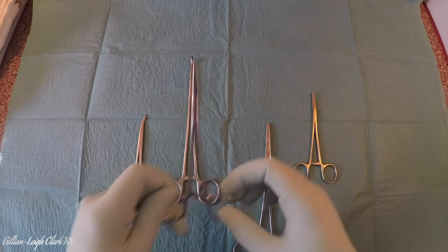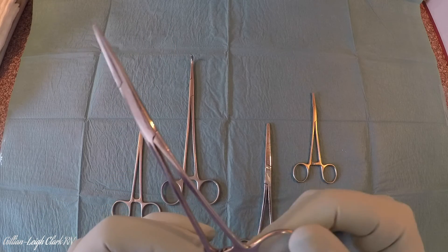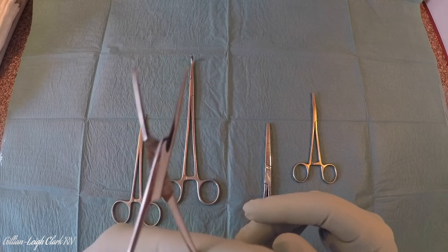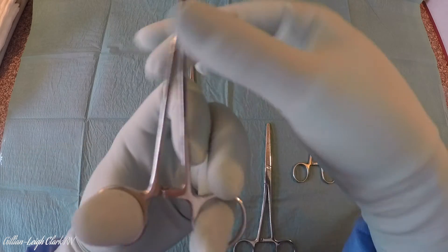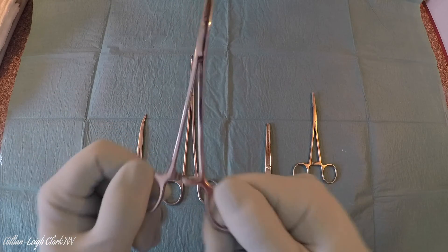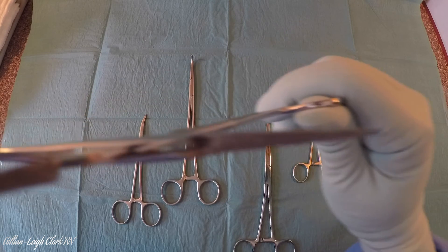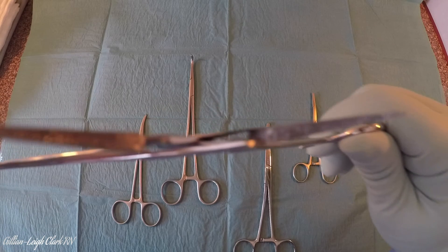Here we have a small one — this is a straight mosquito. A mosquito is a small artery forcep used for small vessels or shallow tissues in plastics and in vascular surgery. It's a very lightweight instrument. But again, we have these scissor-like handles and the ratchet to keep it shut. And if I open it up, you'll see — we have horizontal striations.